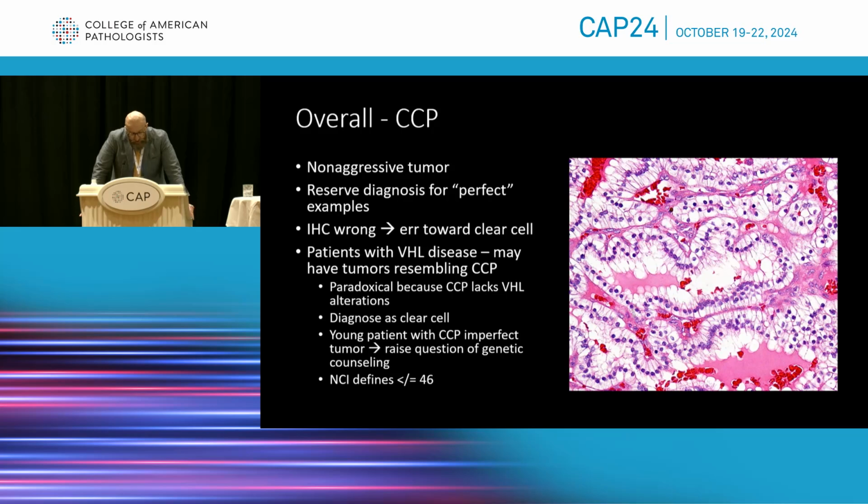And my panel is probably a little bit bigger than that of other colleagues in my group, but I usually do all of those markers that were shown in the table versus others who might do only keratin 7.